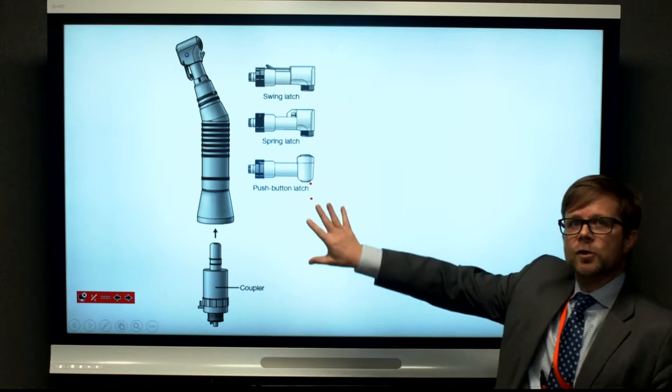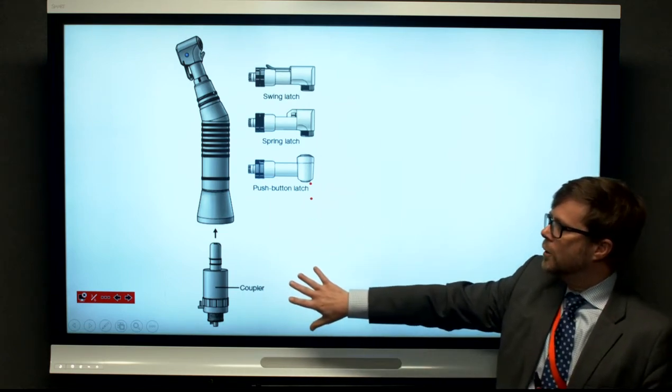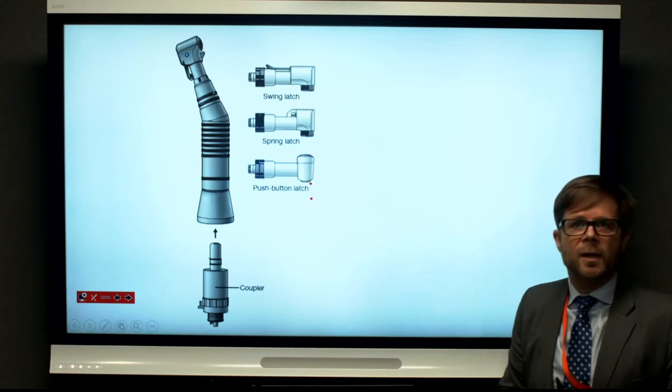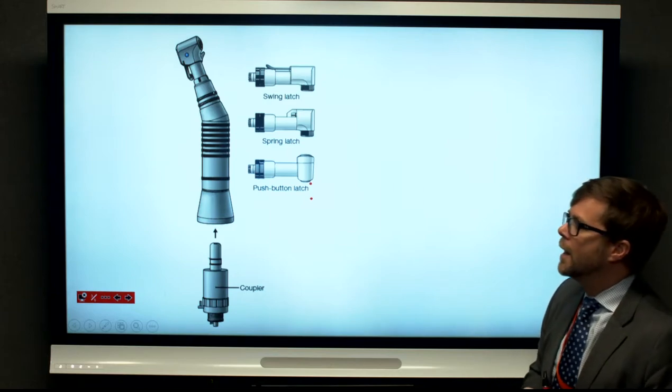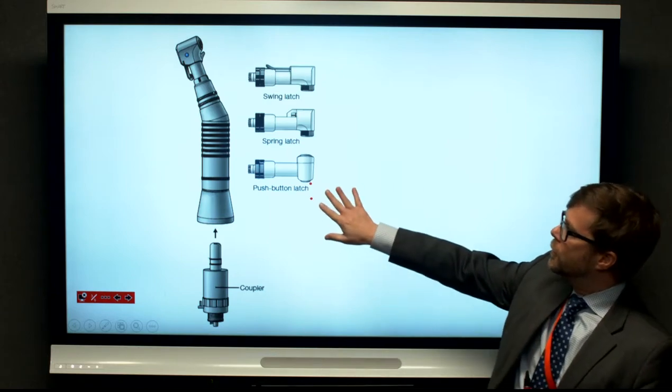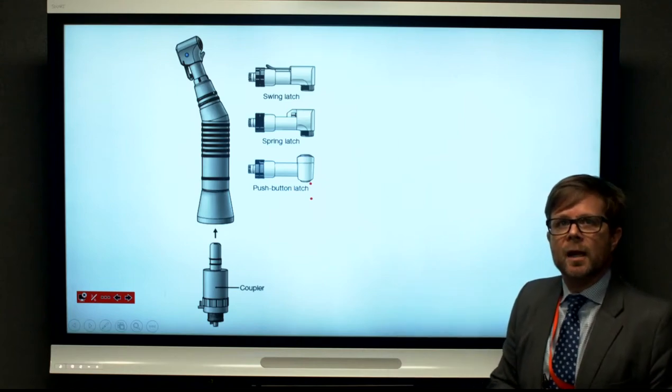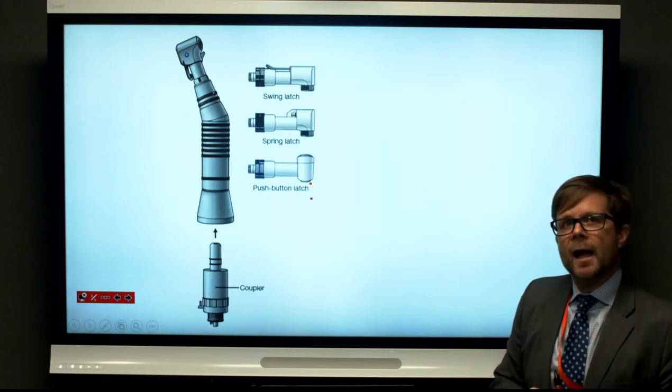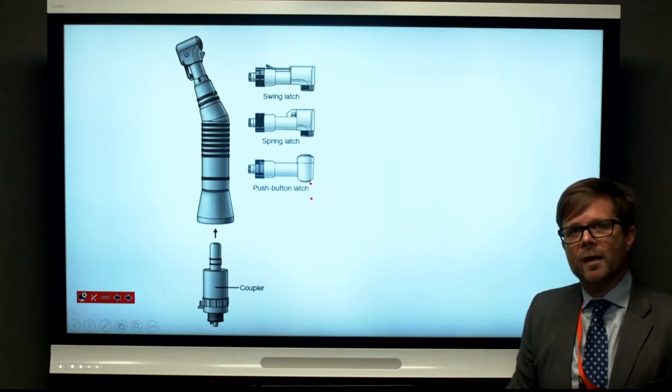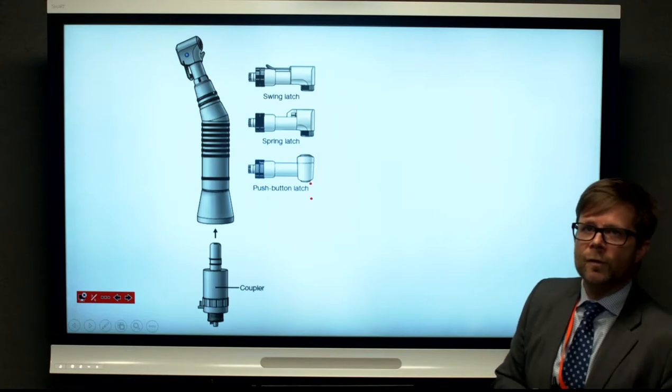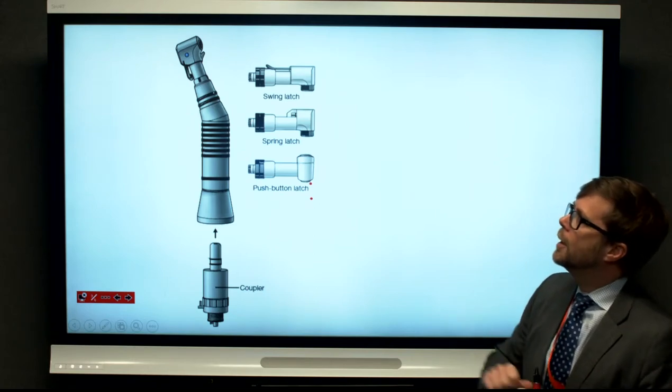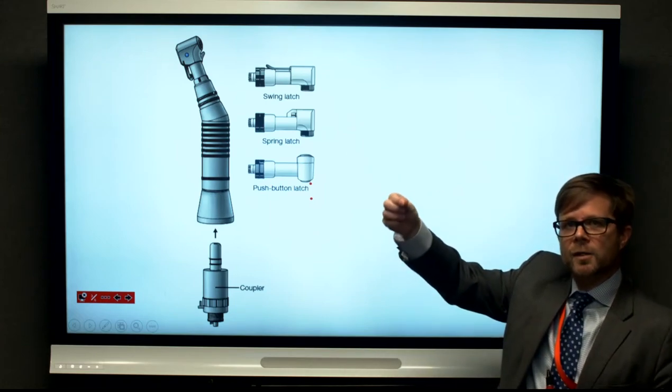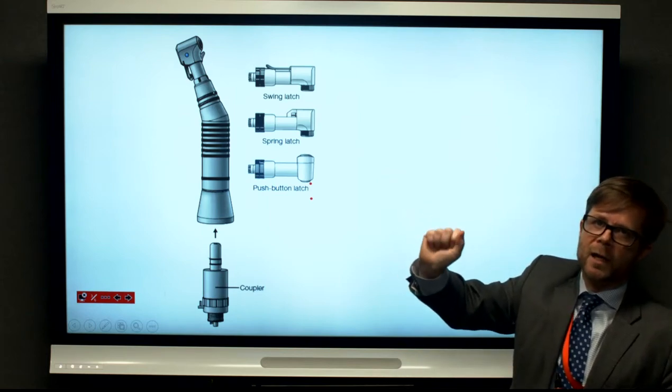So just to introduce you to the slow speed handpiece, there's a coupling or coupler, the handpiece itself. Now the head of the handpiece can vary depending on what sort of handpiece you are using. We've got three here. The top is the swing latch grip head, and you'll find this on the prophy heads that we have in the simulation lab. When you're doing prophylaxis with a prophy cup, you'll use the swing latch. That's a manual latch where you swing the latch to one side, insert the burr into the chuck, and then swing the latch back again.